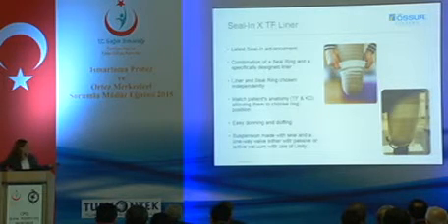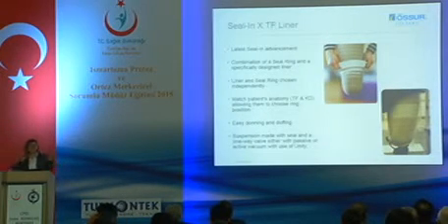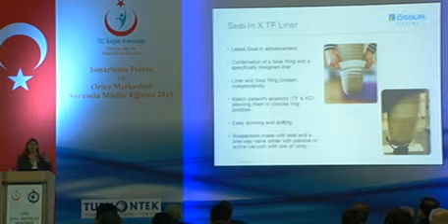And you can see here in the picture below, the liner is pretty high up. What you can do is if he changes the volume, he can pull it up slightly higher or slightly lower depending on the volume, and therefore he doesn't need as many socks as he would normally.